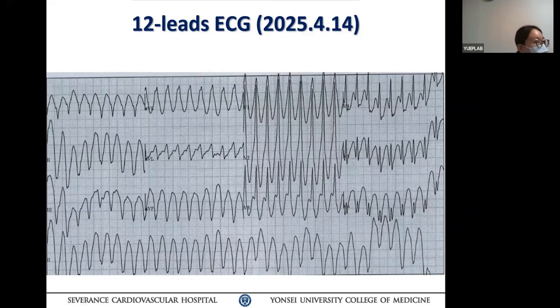And why is it wavy, like oscillating? Lead two. Lead two. Yeah, it's got a wavy thing going on. What does that mean? Either the patient is moving, okay? Or the patient could even be seizing because the attack is so fast. Okay, so this is the evidence that you can subjectively look at the motion artifact, and all this goes into the ECG. So just imagine the clinical scenario.